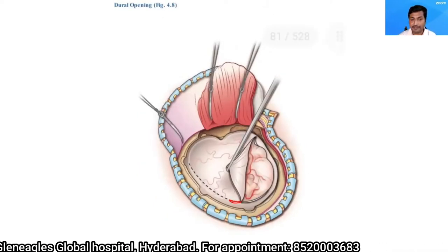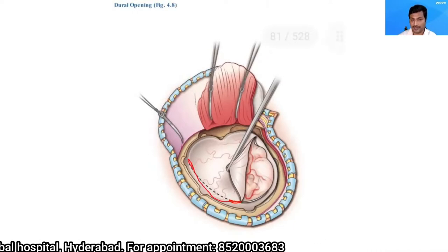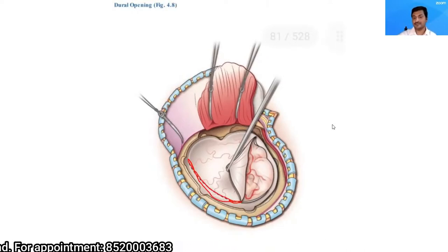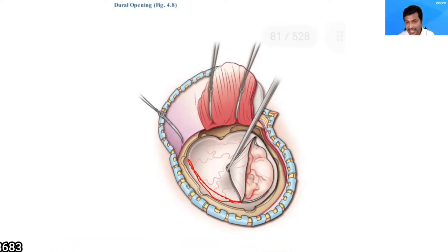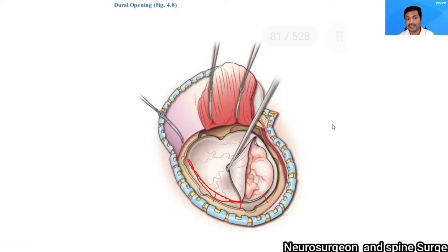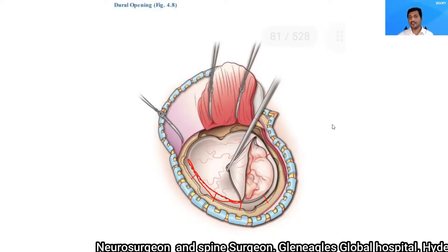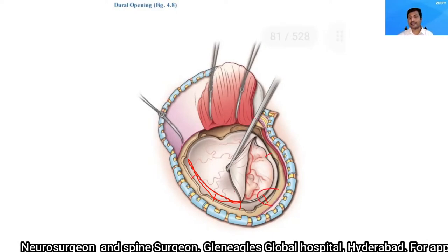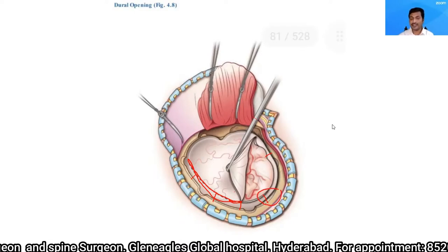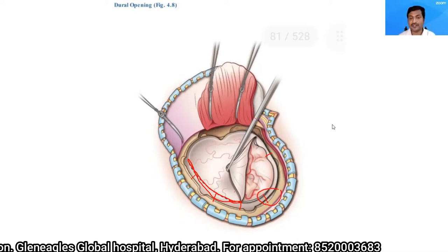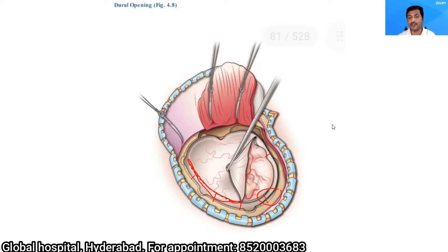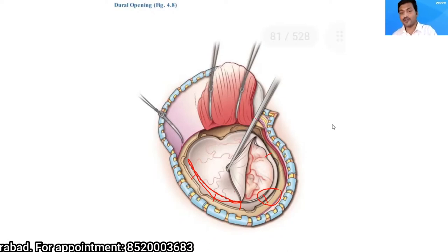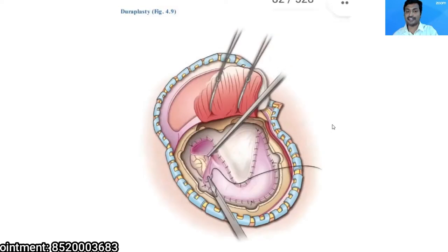In this way, I complete the complete durotomy. After completing the dura opening under vision, I take radial cuts in the dura matter so that I ensure the convexity of the brain is maximally exposed. While taking these cuts, I take all precautions not to injure any tributary going into the superior sagittal sinus.